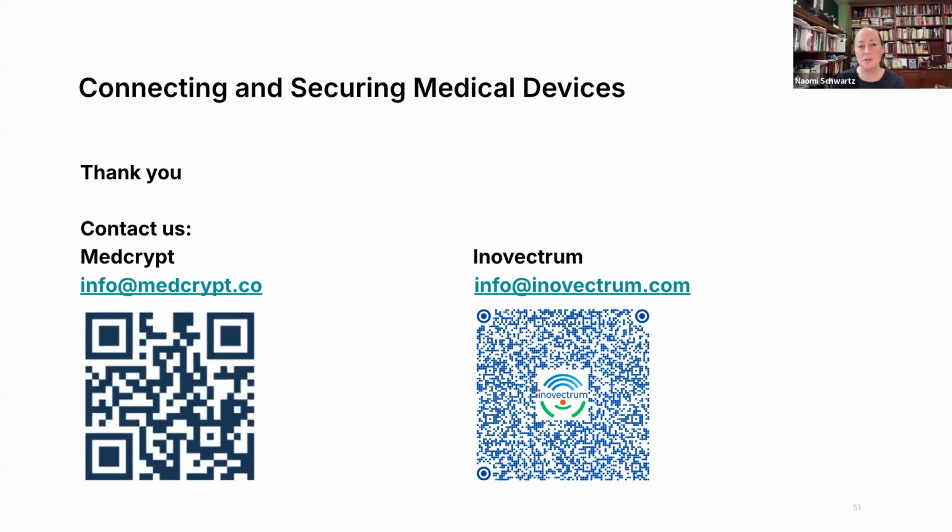Exactly. There's a question about distinguishing FDA's cybersecurity focus on SOUP and software bill of materials and the trends. The trend is, tell me everything that is in your medical device, including the things that it talks to that may be ancillary, because there could be risks associated with that chain back into the device itself, even if it's not a medical device function. So they want you to tell them everything.